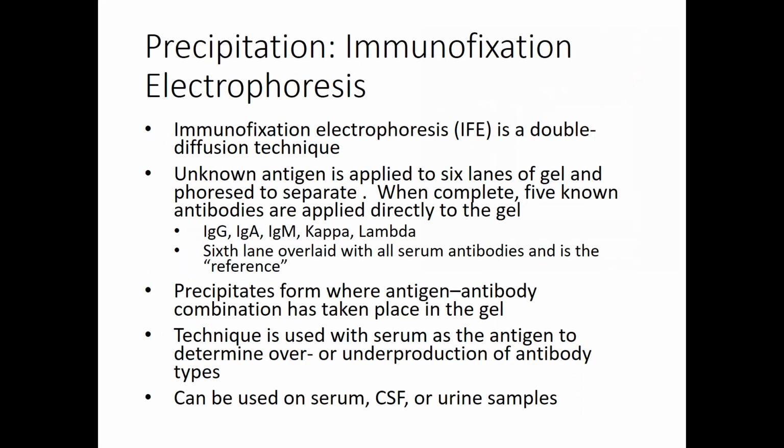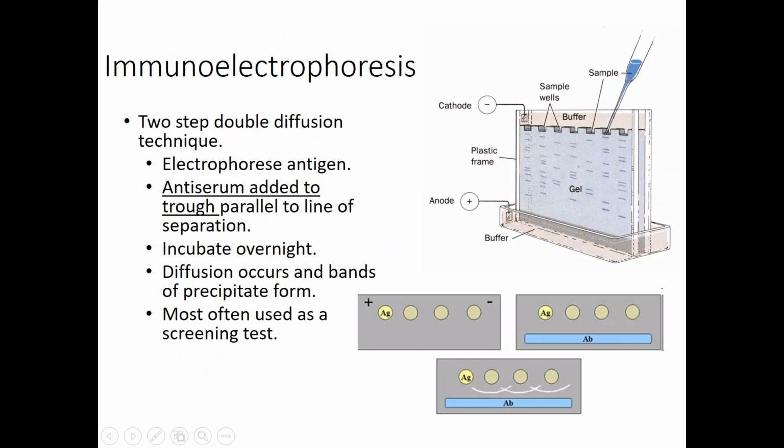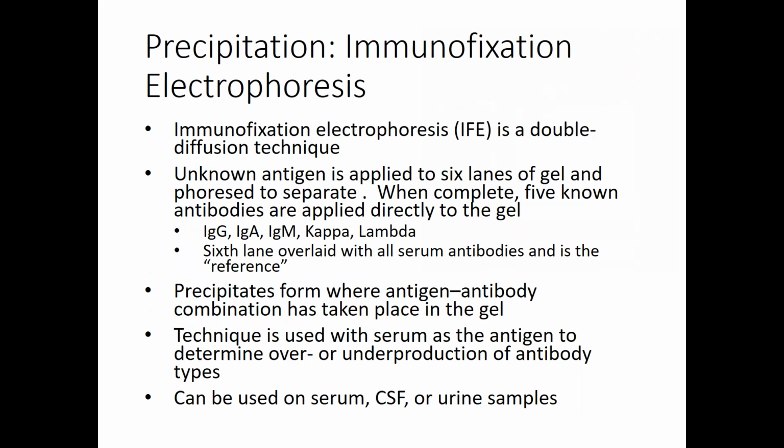It's not anything overwhelming. As I said, so that was immunoelectrophoresis, and I think you can see here there's the anode and the cathode. So in the test method, we actually have applied an electrical charge to help it move along. And there we see the electrical charge indicating that it's electrophoresis.